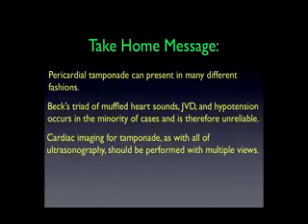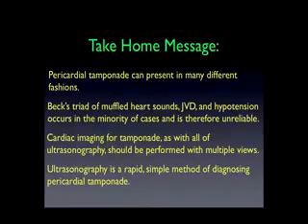Cardiac imaging for tamponade, as with all ultrasonography, should be performed with multiple views. And we can tell from these 4 views that there were certain views that showed the effusion to be much larger than other views. Ultrasonography is a rapid, simple method of diagnosing pericardial tamponade.